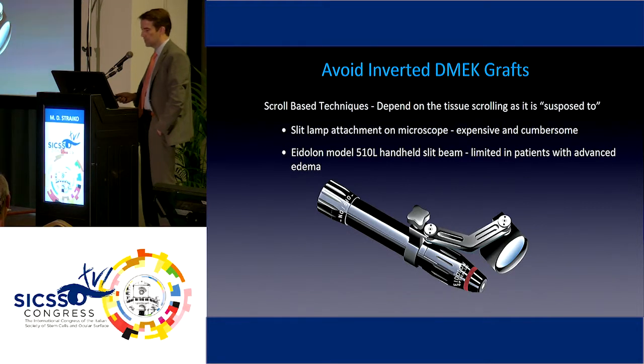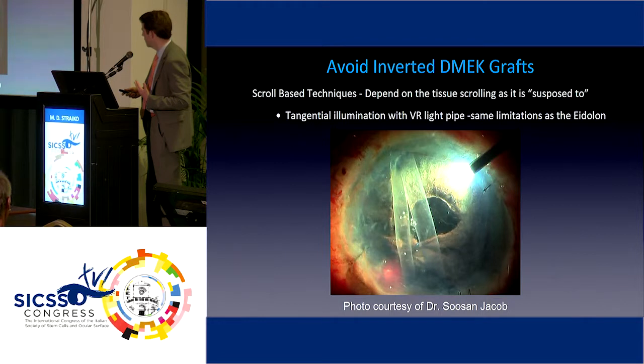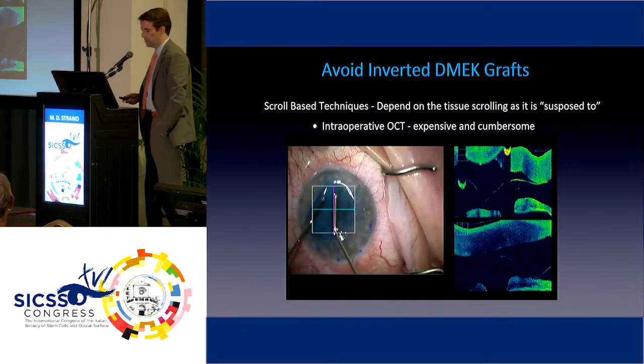So you can also use slit lamp attachment on the microscope, which we found to be rather unwieldy. The Eidolon handheld slit beam is a little better, but I had trouble sometimes interpreting what I was seeing, and if there was advanced edema, it was very difficult. I have a YouTube video on the subject too. Scroll-based techniques, you can also use tangential illumination with a vitreoretinal light pipe. It helps to visualize the anterior segment if you turn off the microscope and use just the light pipe in very edematous cases, but it still can be difficult to interpret the graft position. OCT is another modality, but it is very expensive and rather cumbersome to use.